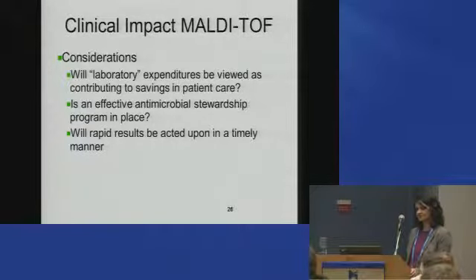And they were just super excited about the idea of being able to get results quickly from the microbiology lab. And then we asked them the question, if we give you rapid results, are you going to be able to utilize them rapidly as well? Because what use is a rapid micro result if it's not going to be utilized in rapid real time for clinical use? So we really wanted to ask that question of them as well. And so our antimicrobial stewardship team comprises a group of individuals that includes ID physicians, ID pharmacists, clinical microbiology, infection control, the LIS folks, the epidemiology folks, and of course, centered is the patient.